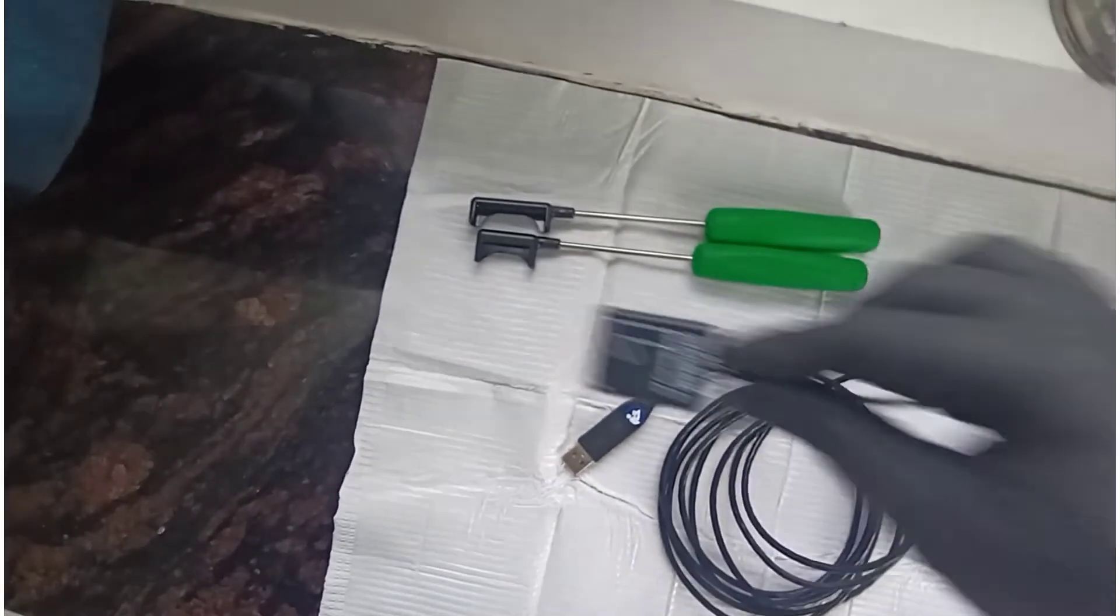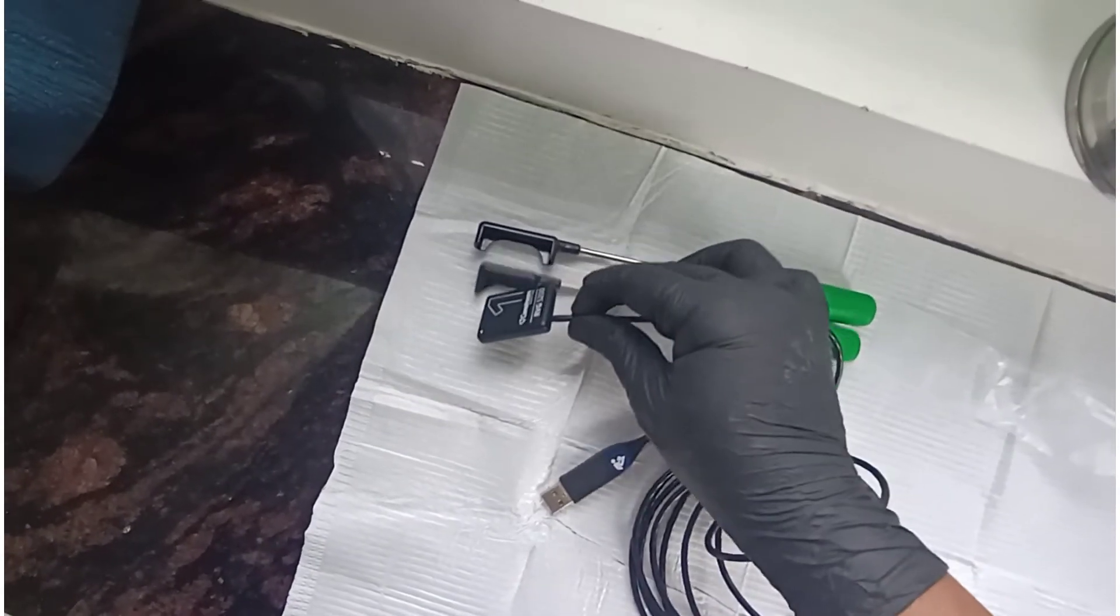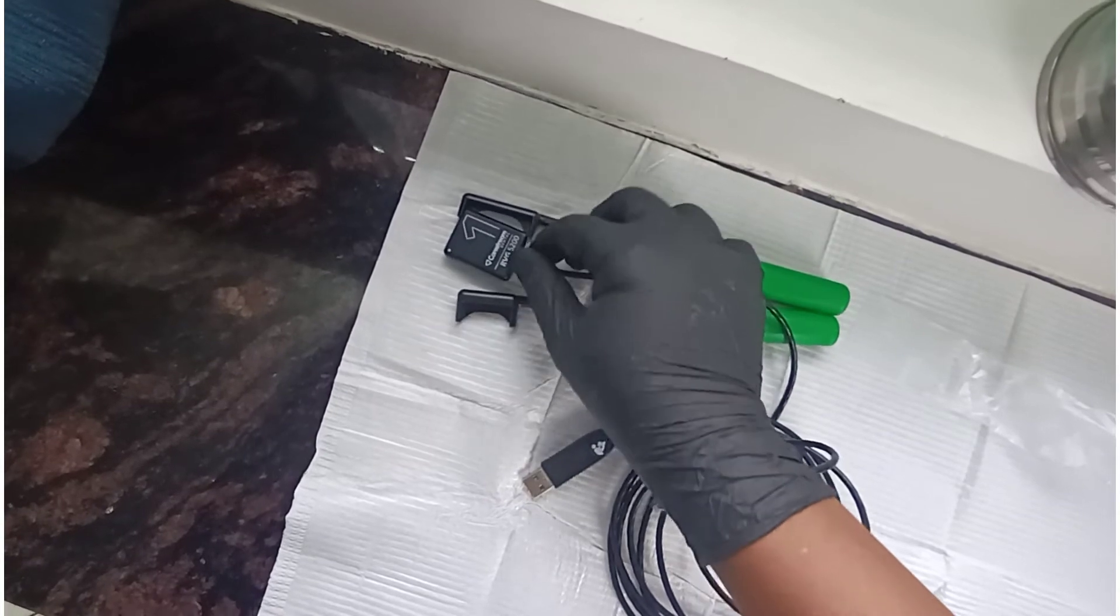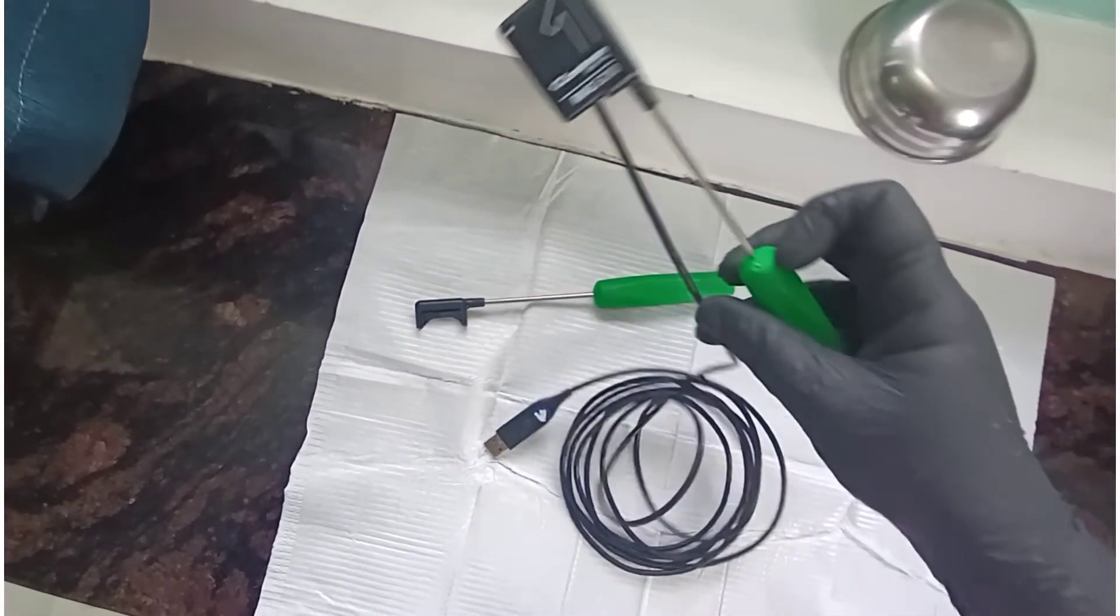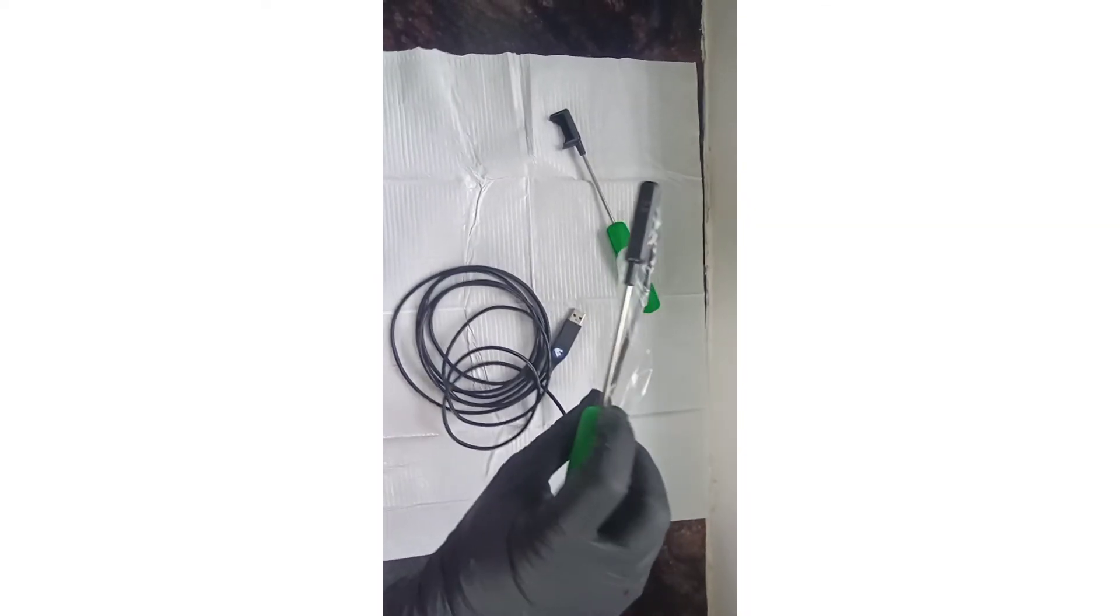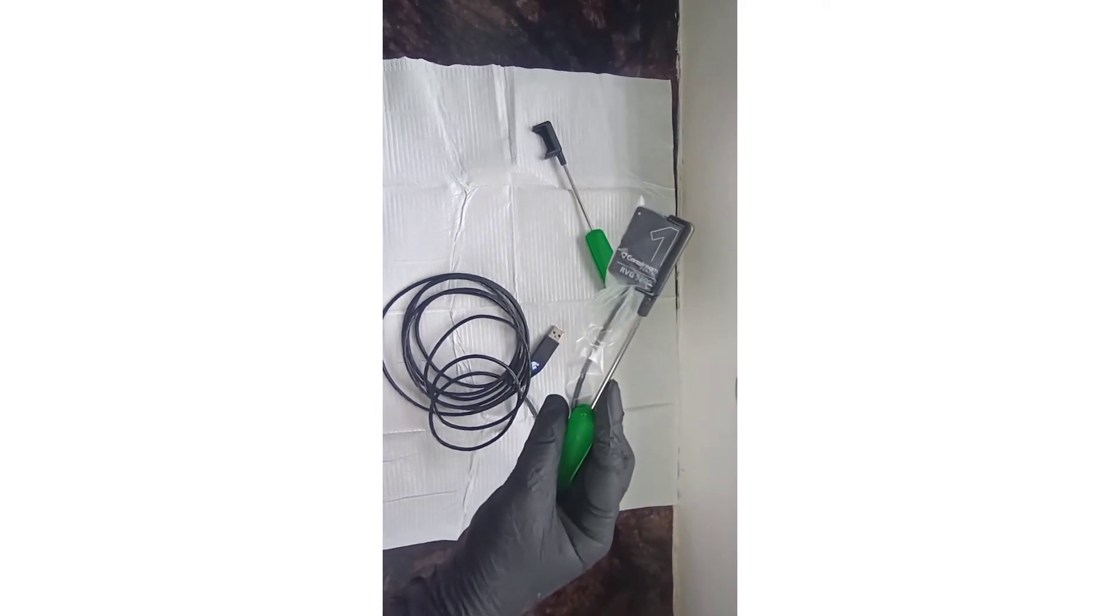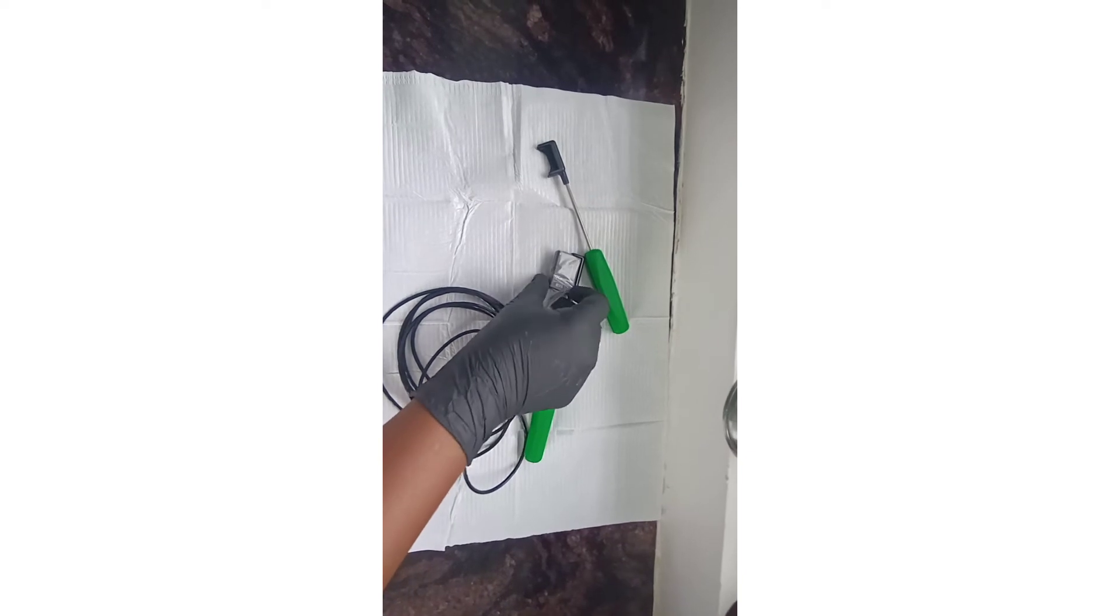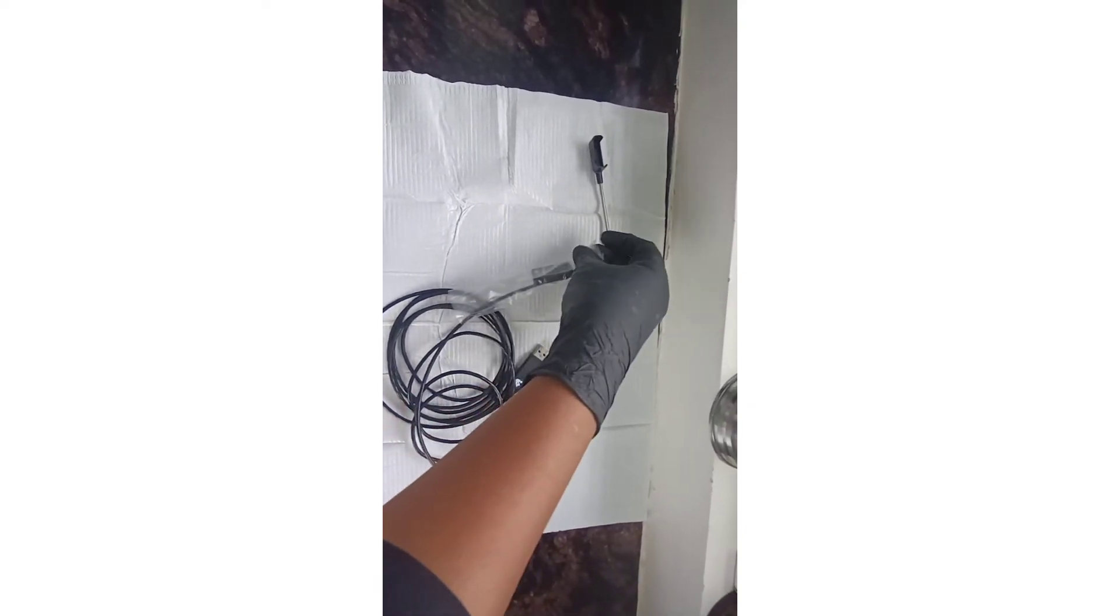I'll show you how it's attached. It's very easy to attach. Once the sleeve is on, you can attach the sensor to the handle and place it in the desired position in the mouth. It's very easy to remove once you're done with the x-ray.